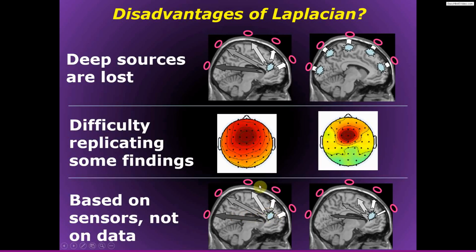Here you would want to apply a stronger filter, and here, where these electrodes are maybe less strongly intercorrelated, you would want to dampen the effect of the spatial filter. There are other spatial filtering methods that do incorporate the data covariances, like beamforming, but the Laplacian is a fairly simple method that does not incorporate the actual signal characteristics.